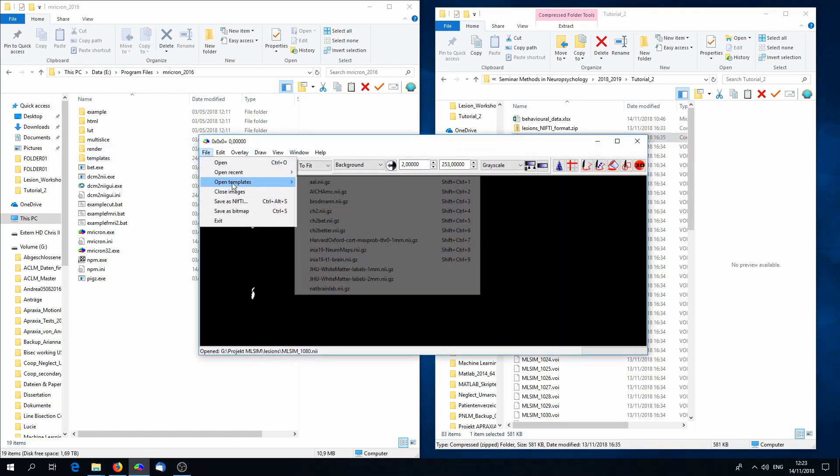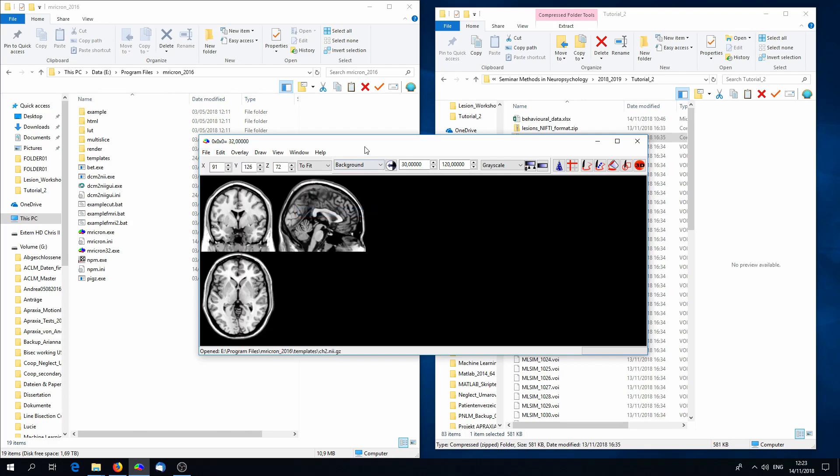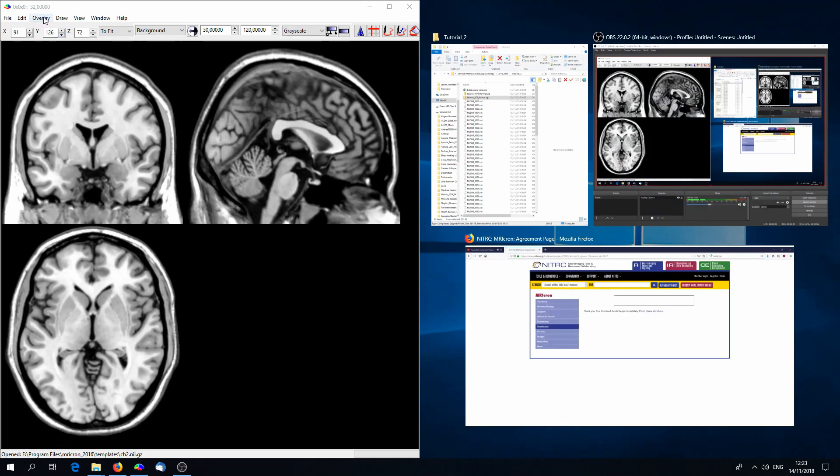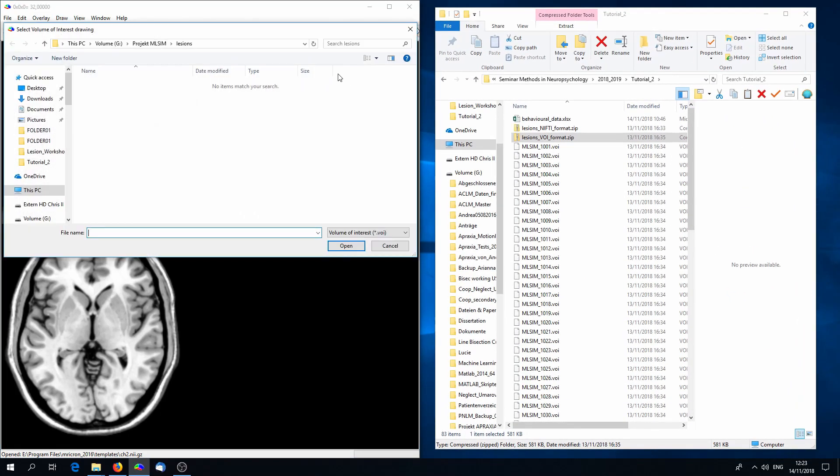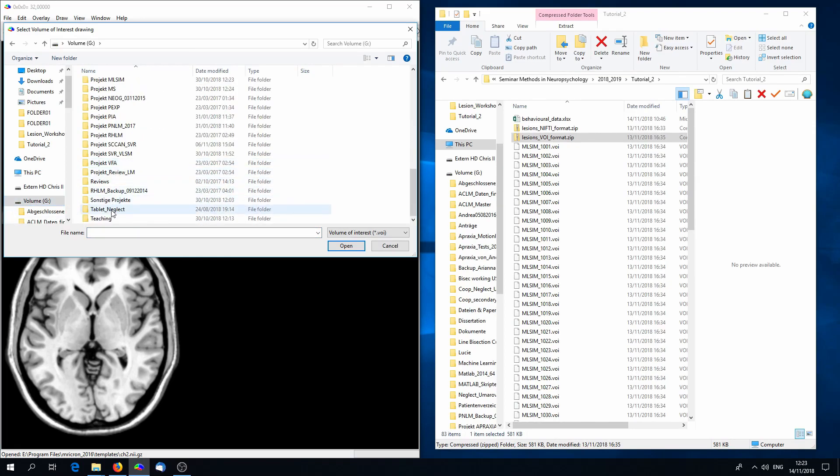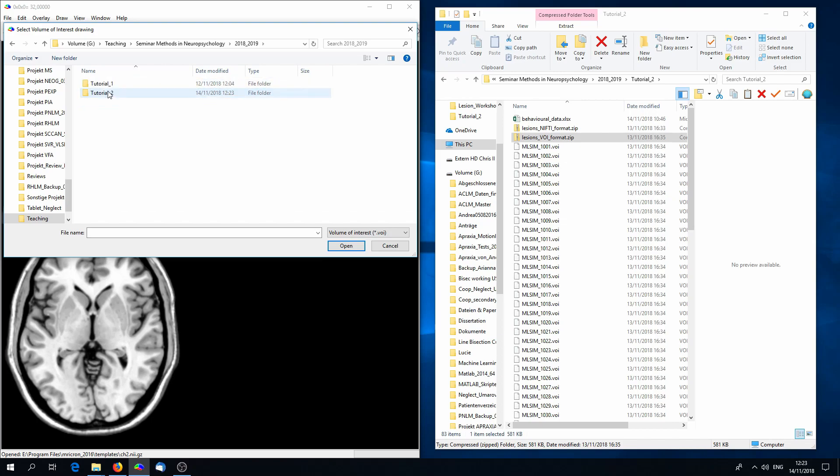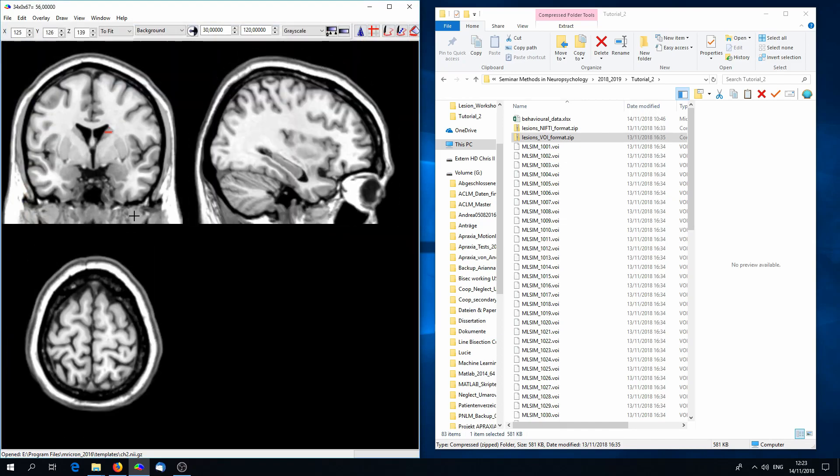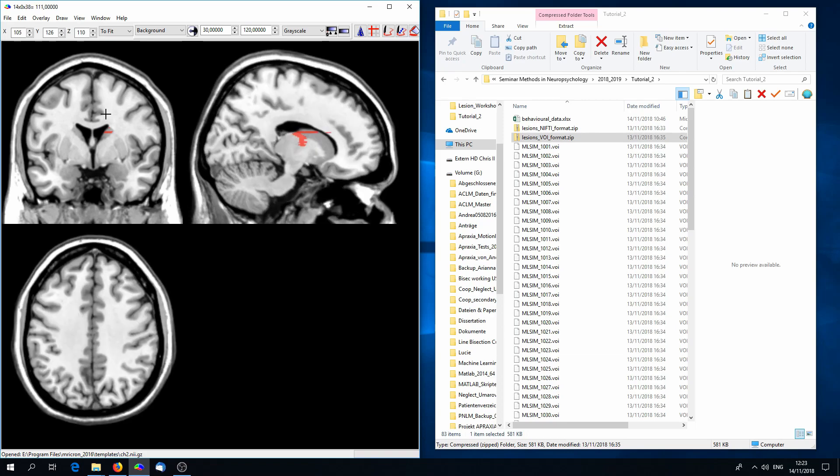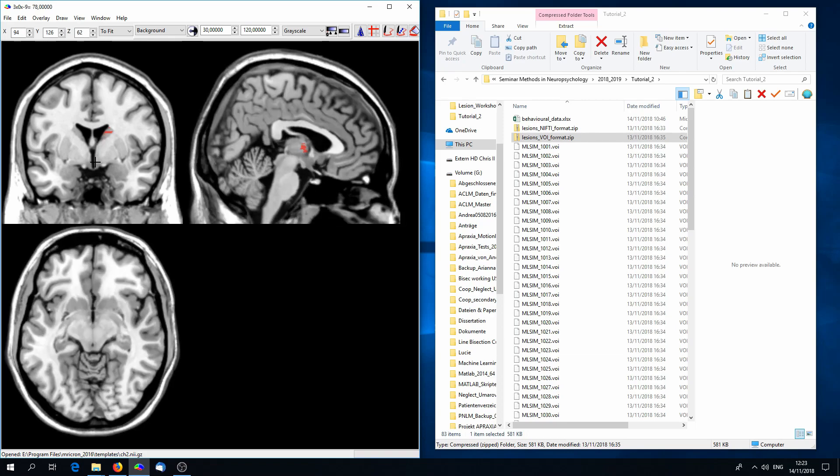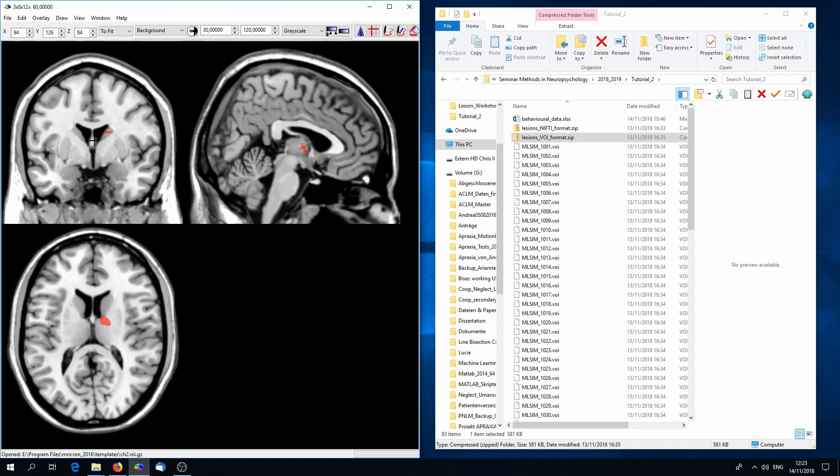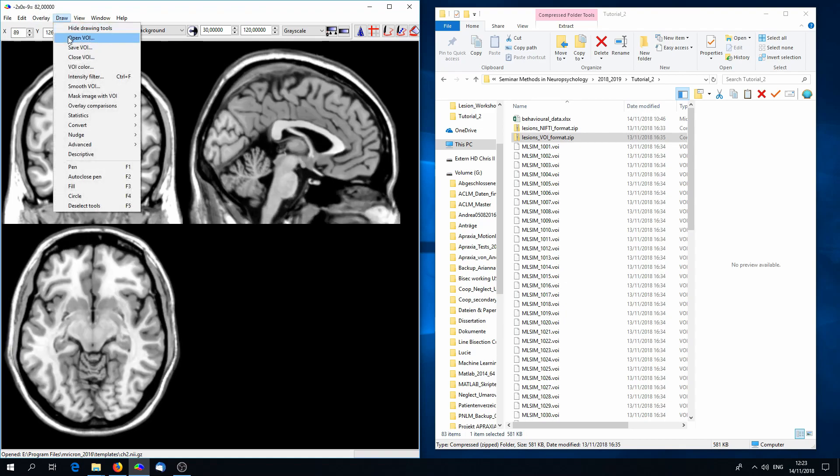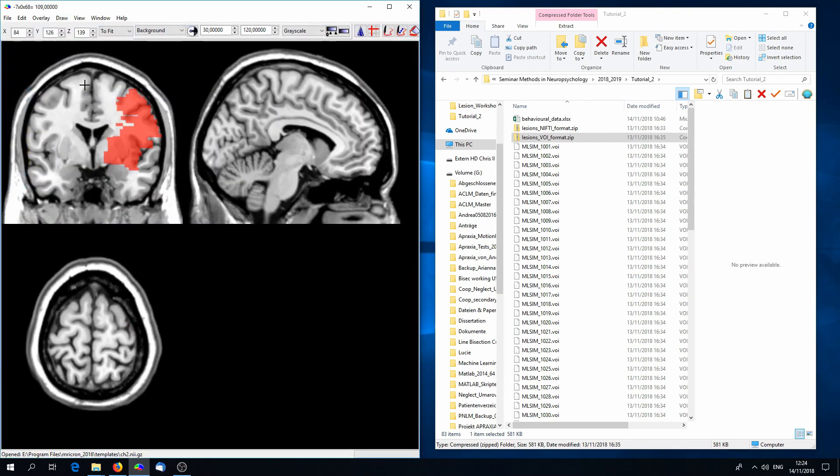You can open lesion images in MRI-cron. Go on File, Open Template, and choose a template that I like CH2. If you now go on Draw, Open VOI, you can open a VOI file. And we see that this is a normalized lesion map. Open VOI can also open other formats like Nifty, so feel free to also look at Nifty files here.